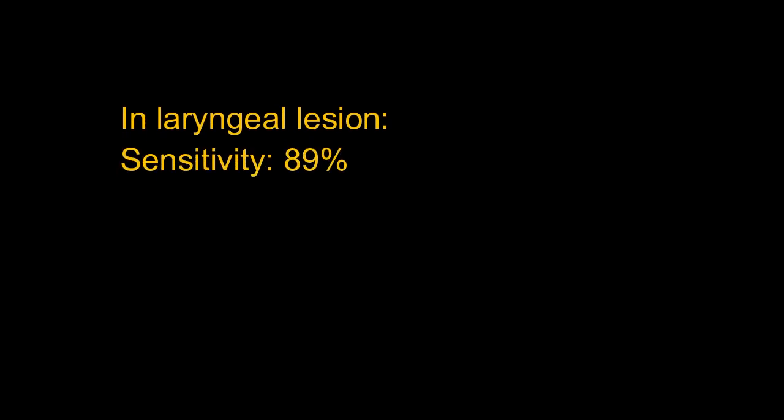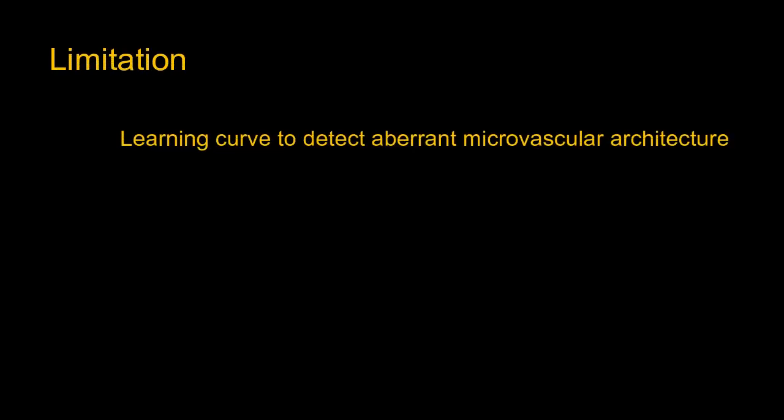Narrow band imaging has a sensitivity of 89 percent and a specificity of 93 percent in the diagnosis of primary laryngeal lesions. It does have some limitations — a learning curve is required to understand aberrant microvascular architecture.